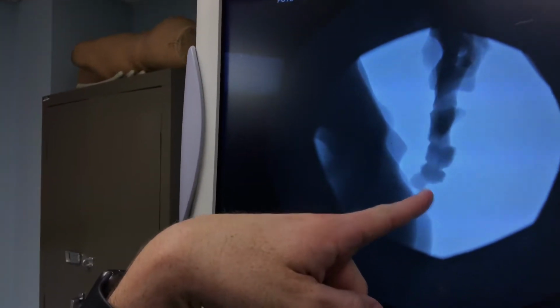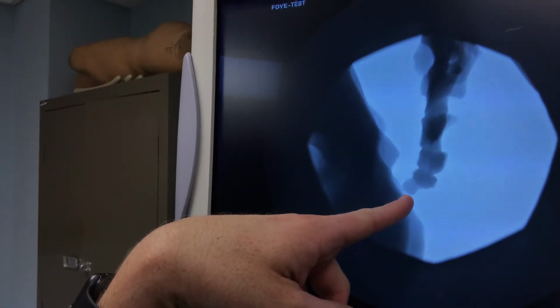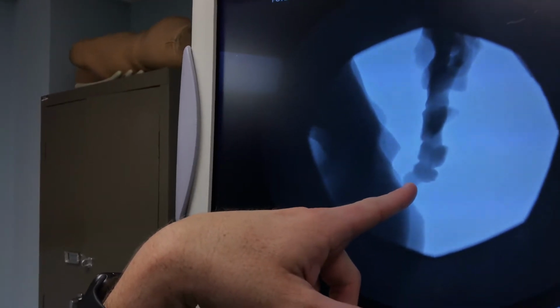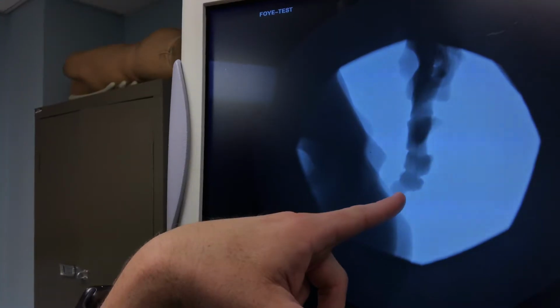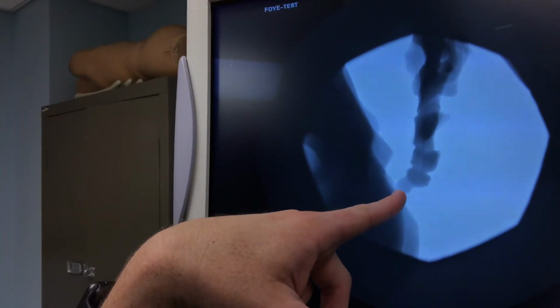And here's the lower tip down here. For many patients, we'll have a bone spur down on the lower tip of the tailbone, and that needs to be made as a diagnosis from the patient's x-rays or MRI or CT scan, or sometimes you can detect that even on physical examination. But then you want your injection to be specific to what the patient's abnormality is.